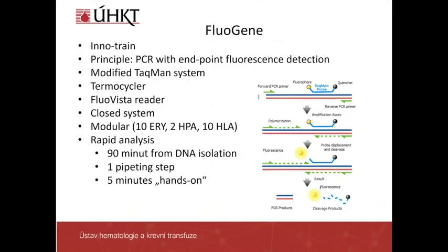The Fluogene system is using endpoint fluorescence detection with a modified TaqMan system, and it's quite rapid and easy to work with.